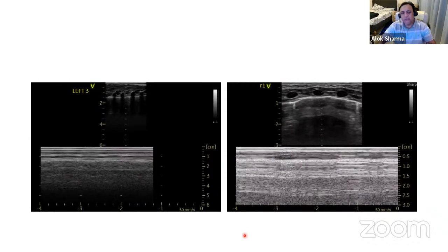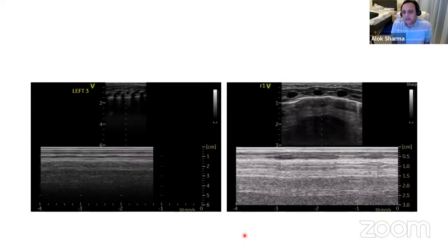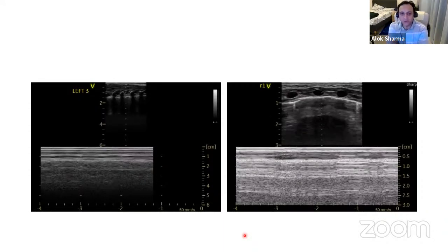And that's why it's very important for you to do all your lung regions anteriorly. With any baby who has respiratory distress in the first, I'd say, few hours of life, keep all differentials in mind. The reason you want to know this is, what if this baby suddenly deteriorates in a few hours? Inevitably, we will continue doing x-rays. But our French colleagues, knowing this, would obviously suspect and do a quick lung ultrasound to see if that pocket of air has actually increased in size.